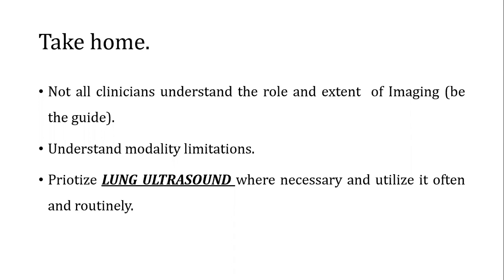Now, in my department, any chest X-ray where I see any suspicion of opacification, be it small, I do lung ultrasound. Now, this particular gentleman, we found out he had very thick echogenic fluid collection. At aspiration, it was found to be pus, empyema. And the aspiration was done with a vacuum pump. A needle could not pull it out because it was so thick.